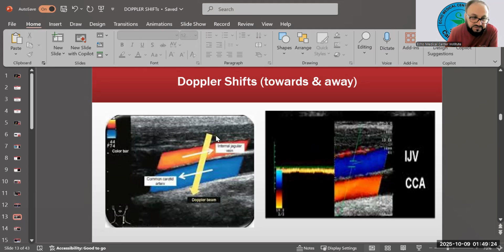So I cannot represent this picture anywhere in a file of a patient, because I see that the patient has no problem, a completely normal patient, just the box steered to the left. And it will represent that the flow is going that way and the flow and pulses are in completely opposite directions of each other. And in the jugular vein, it looks red to me. But like I said, click that button or knob which says invert. And now this picture is more diagnostic compared to this one, if the patient has no problem.